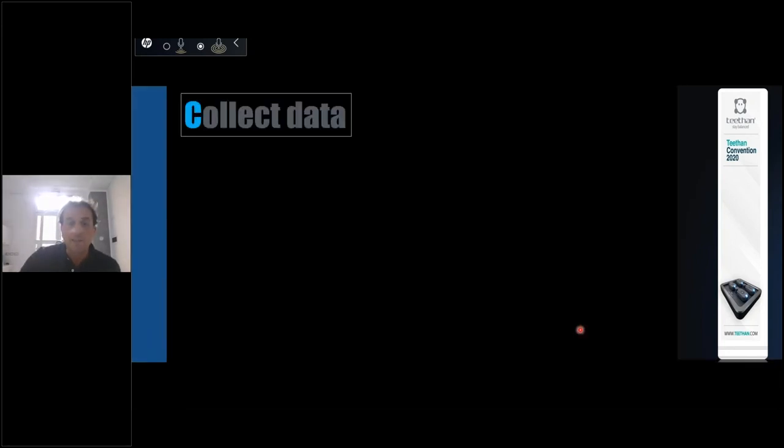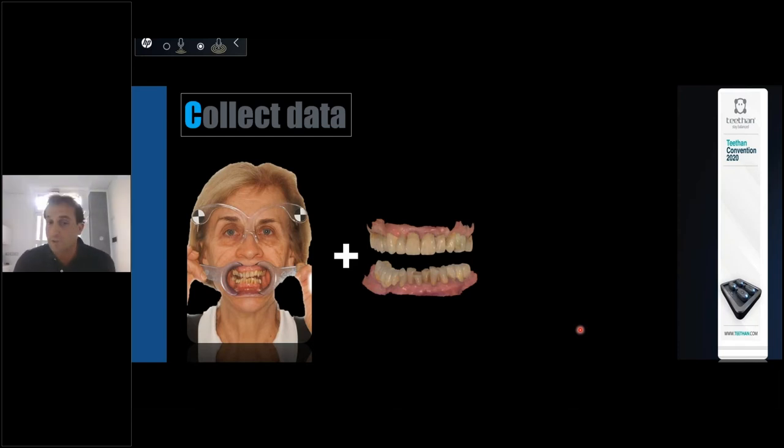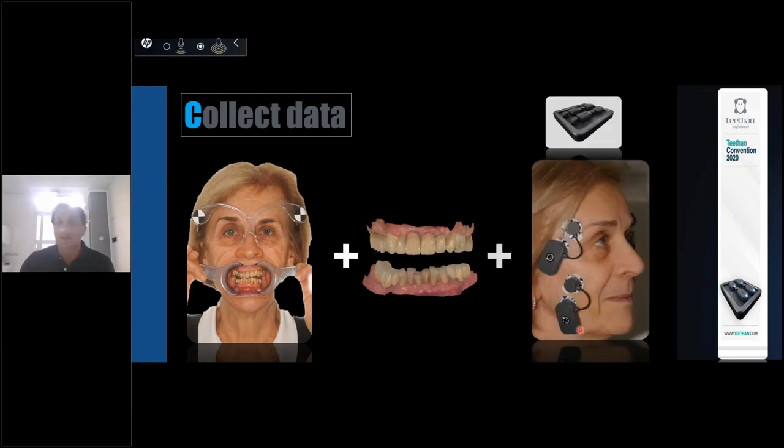At the end of this exam, I collect more data, for example, digital impressions. So I took two pictures in the first visit, two digital impressions, and I did this exam with Teethan. For me, it's very important in the first phase of the first visit. I want to know something more about the patient, okay?